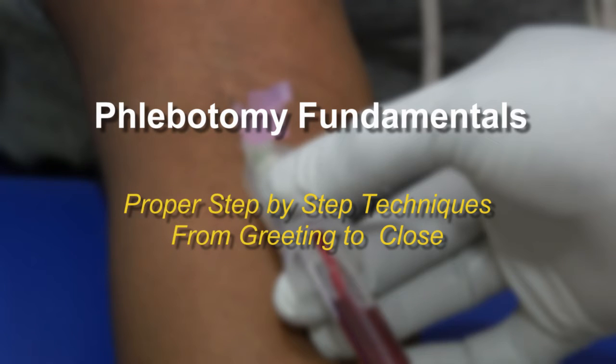Welcome to Phlebotomy Fundamentals. In this video, you will learn proper step-by-step phlebotomy techniques from the time of patient greeting to the close. Let's begin.